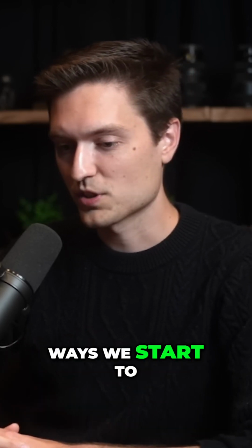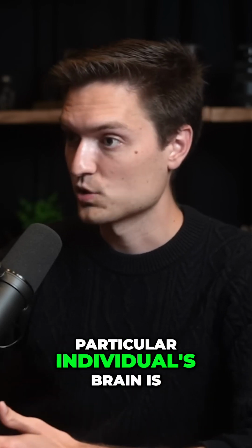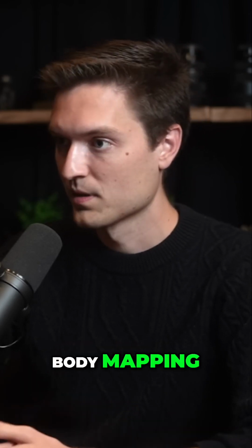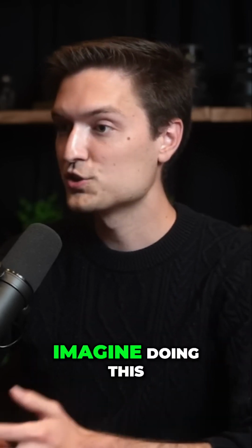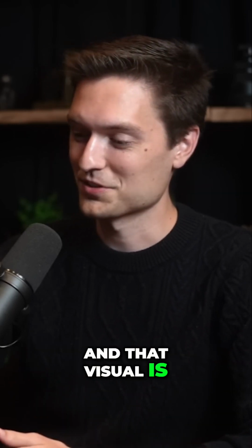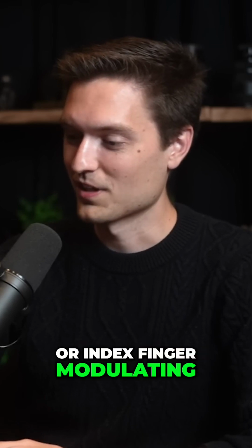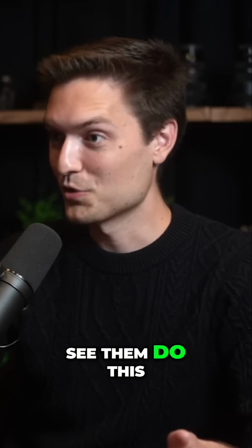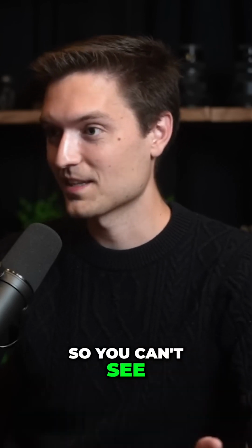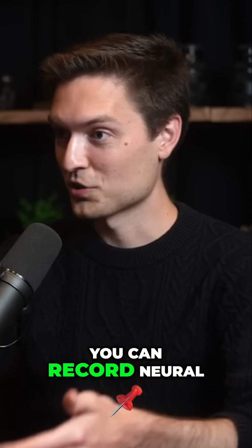So one of the ways we start to map out what kind of signal we actually have access to in any particular individual's brain is through this task called body mapping. And body mapping is where you essentially present a visual to the user and you say, hey, imagine doing this. And the visual is a 3D hand opening and closing or index finger modulating up and down. And you ask the user to imagine that. And obviously you can't see them do this because they're paralyzed. So you can't see them actually move their arm. But while they do this task, you can record neural activity.